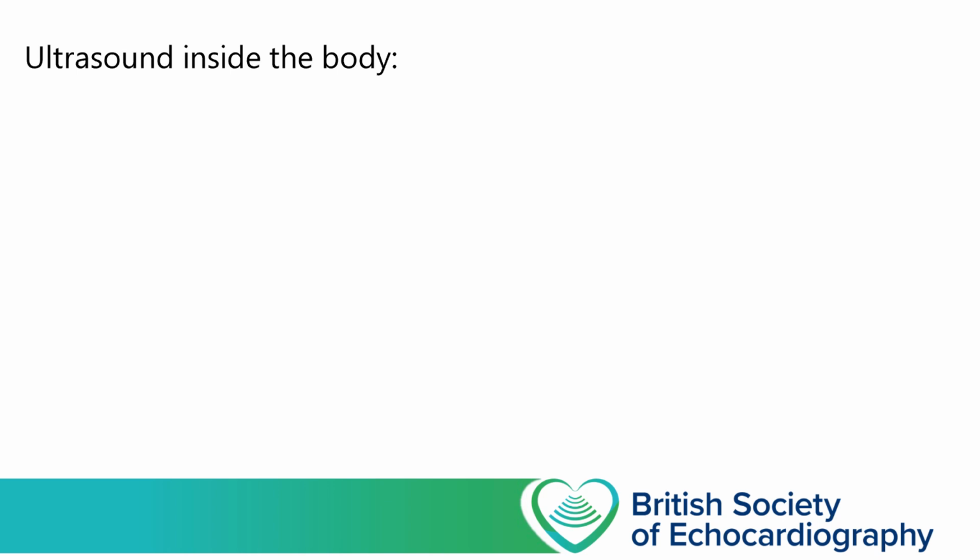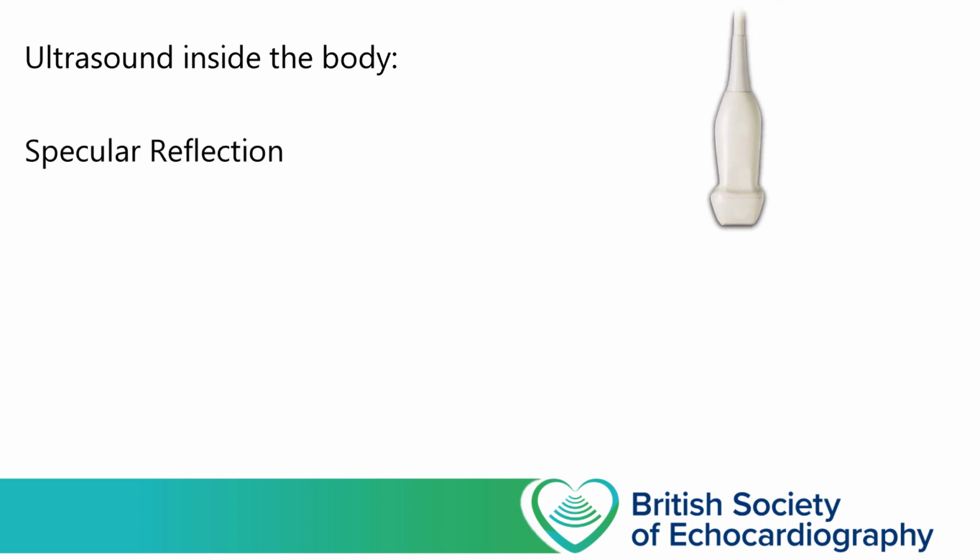Okay, so now that we understand how we've generated a wave of kinetic energy, let's now consider what happens to that wave once it passes into our patient. So what can happen to that wave? Well, some of the energy will be reflected straight back towards the probe. This is essential because the whole basis of using ultrasound to image the body relies on the fact we can reflect energy off structures within the body and detect it as it returns to us.